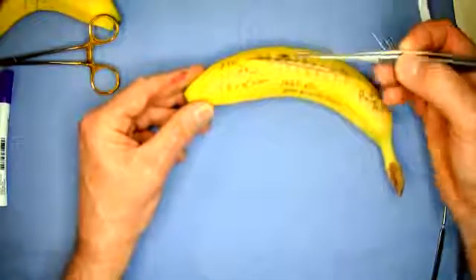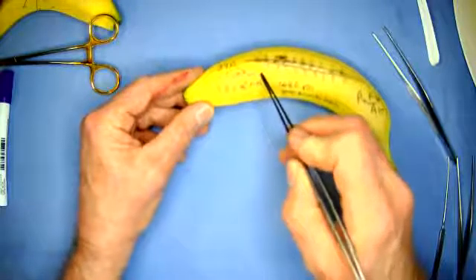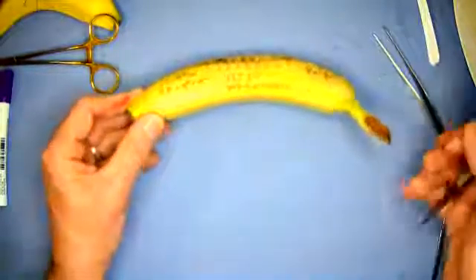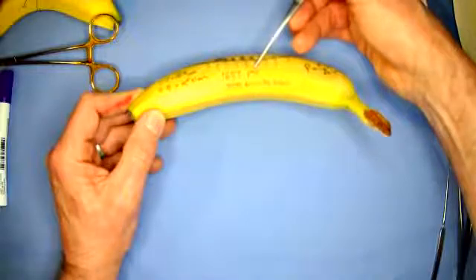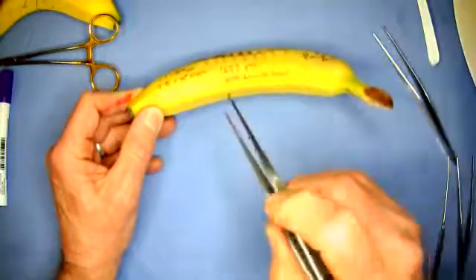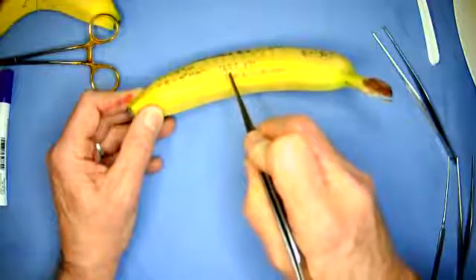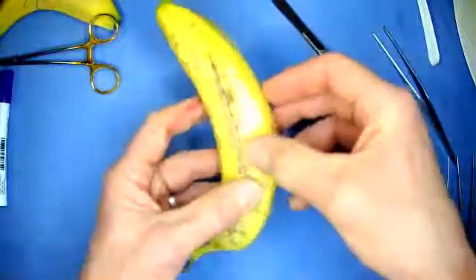And on the banana, I calculated the area at the tip of my DeBakey forceps as 7.5 times 10 to the minus 6 meters squared. And that translates to a pressure of 11.6 times 10 to the 6 newtons per meter squared. And for those of you who are interested in the old terms, that equates to 1,682 psi. Well, that's more than half the psi that you require to put concrete on your drive safely. Concrete on the drive is 3,000 psi, and your forceps can generate 1,682.